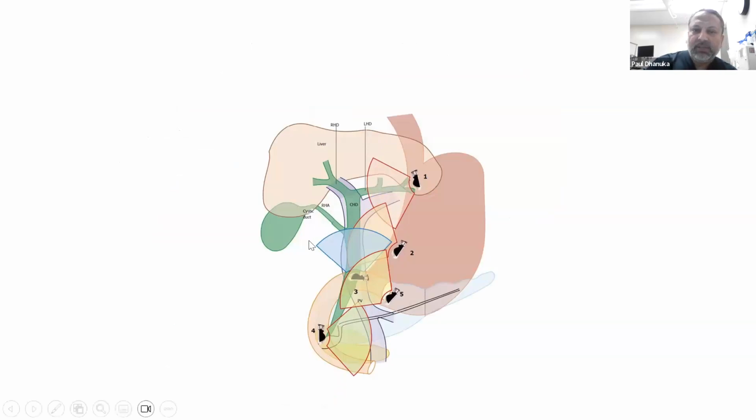So this is another diagram where the esophagus, and this thing is the EUS probe. It's showing what area you can see near the GE junction or cardia, then from the body, then from the duodenal bulb, and then the last third portion of the duodenum. So we go to different areas in a systematic fashion to interrogate all these specific areas. You can see part of the liver, but not the entire liver.